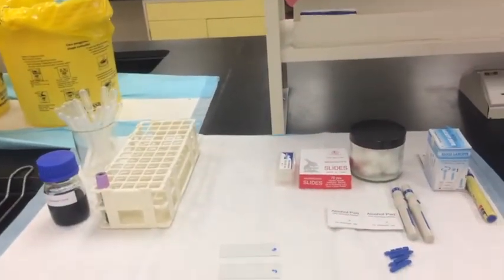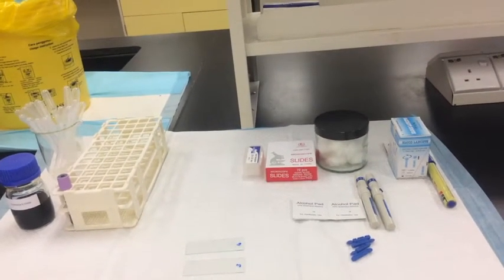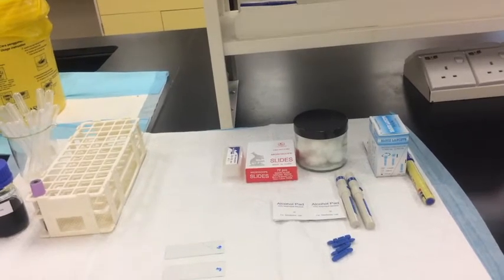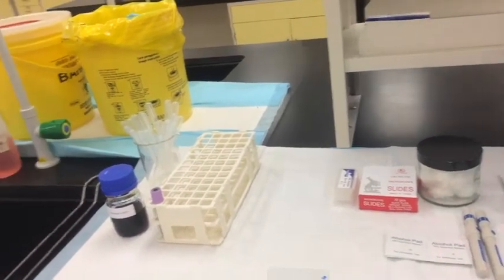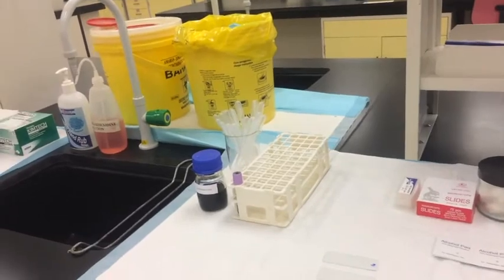Hello, good morning. This is a video presentation on preparing the blood film or blood smear and staining. The person who is going to be helping is our lab technician, Effendi Hatta.